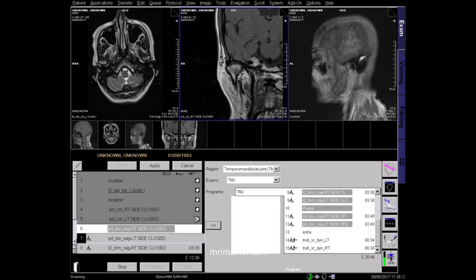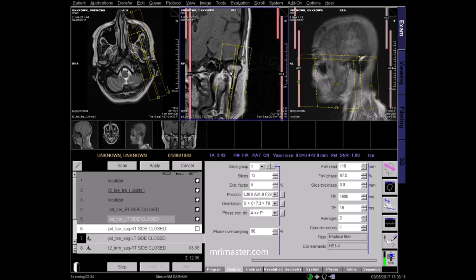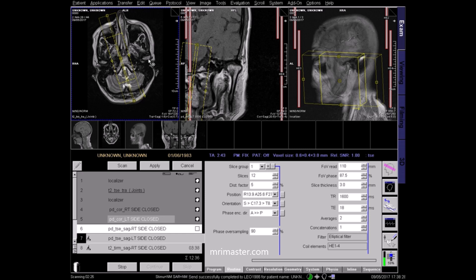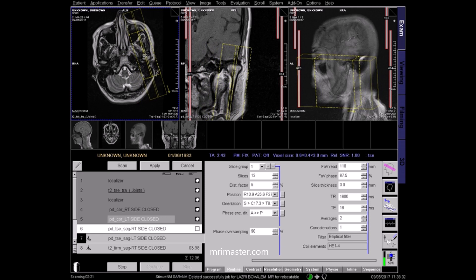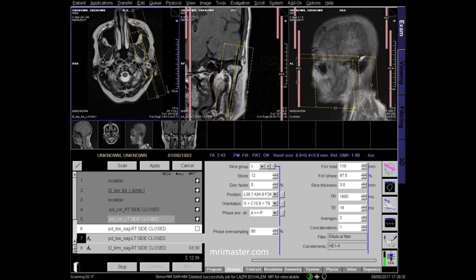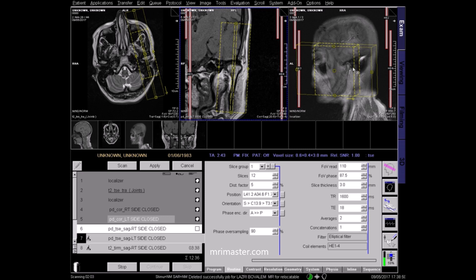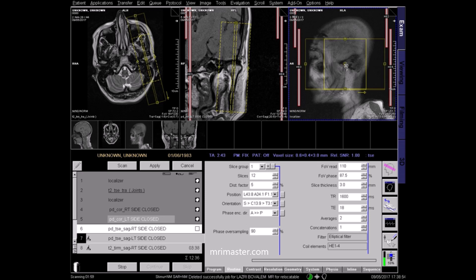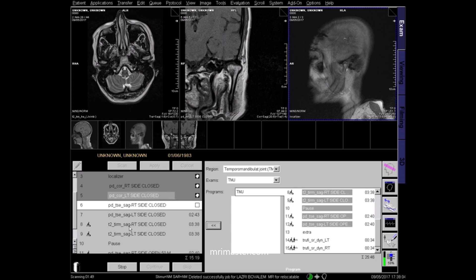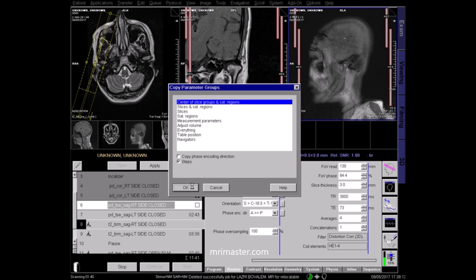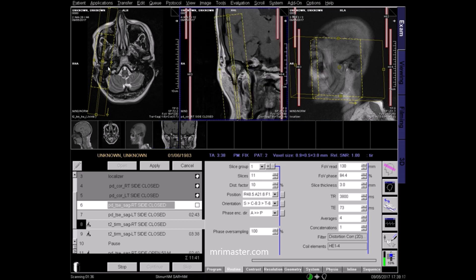Follow this planning on the left side for the left TMJ by bringing up the acquired left coronal PD image. Angle perpendicular to the long axis of the condyle on the axial plane. Angle along the ramus on the coronal plane. For the T2 STIR sagittal images, copy the planning above. Be sure to copy the planning of the correct corresponding side. Check and apply.